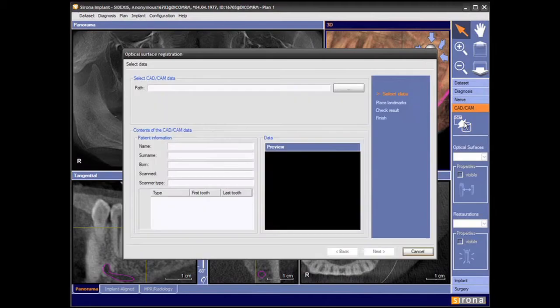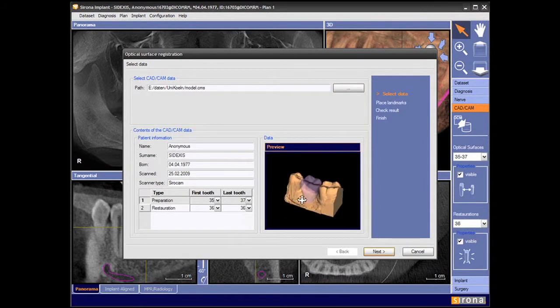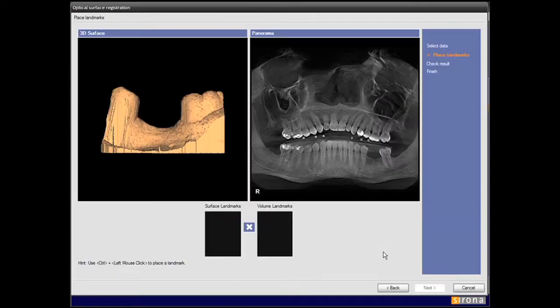You open up your Galileo software, you do a couple of clicks to kind of match up the points on the edentulous area on the X-ray system and the edentulous area on the CEREC scan, and the software does the rest. There's really no learning curve. It's one of those see one, do one, teach one type of instances.